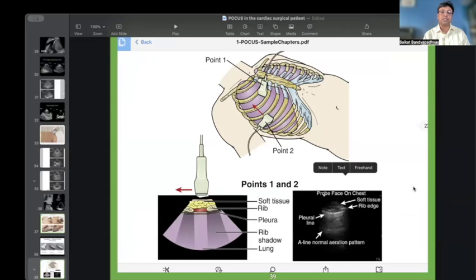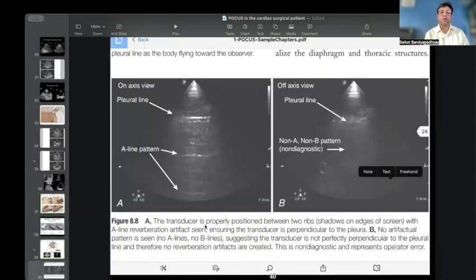Now, the very classical image for a lung ultrasound is this particular thing. You have a window through two ribs, and this is a phased array probe, and you can see the rib shadows falling over here, causing what we call a bat wing pattern. In between, you can see a normal lung. Very important over here is to identify, using a phased array probe, these white lines. In a normal lung, you'll have these white lines at definite intervals, which are parallel to each other. These are reverberation artifacts, and these are called the A lines. These artifacts are a normal part of a normal lung.